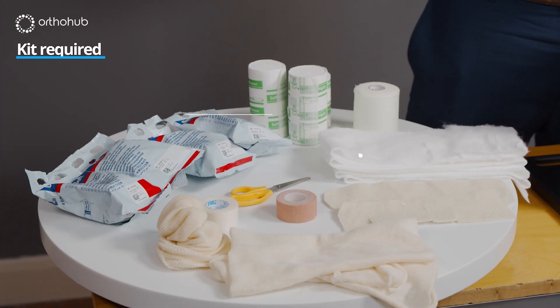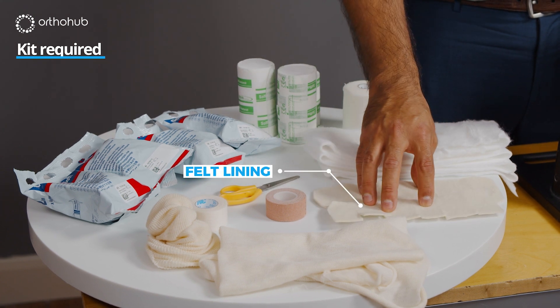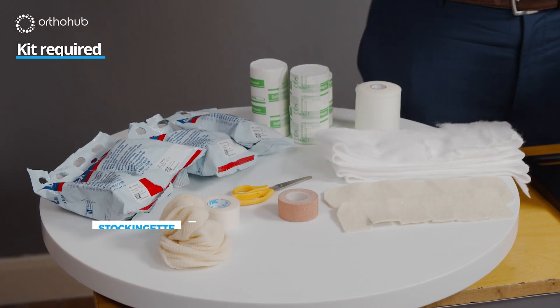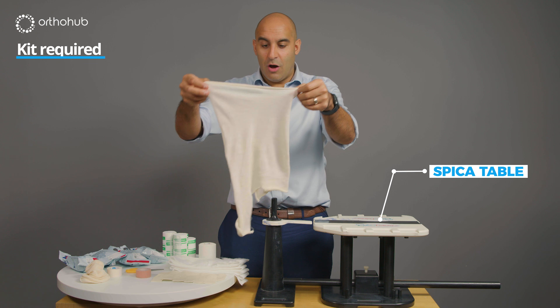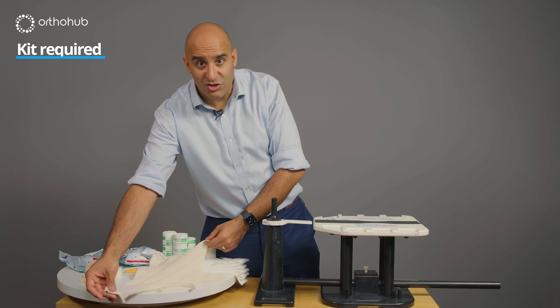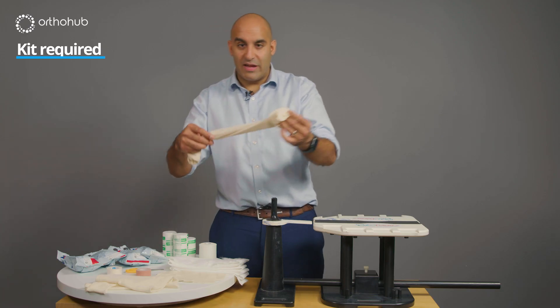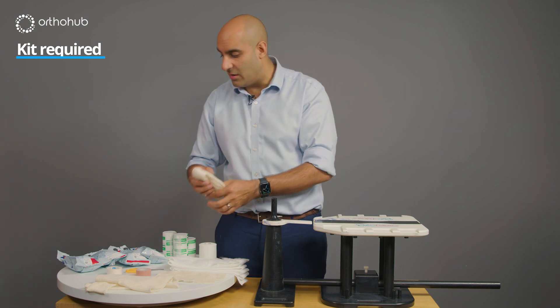The materials we need: first we've got some fluff for the belly, and some felt for the lining of the cast so it doesn't cause any irritation to the skin. We then have our stockingette for the body — we've cut out the section that goes up the abdomen, the part for the good leg which is left alone, and a bit that goes down the fractured leg extended, covered by a single narrow stockingette used essentially as a cylinder cast.